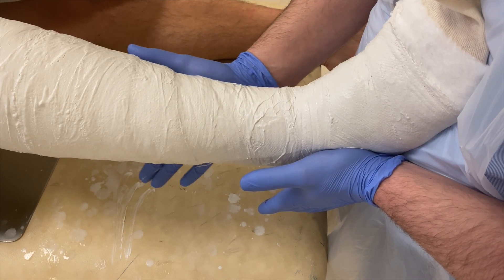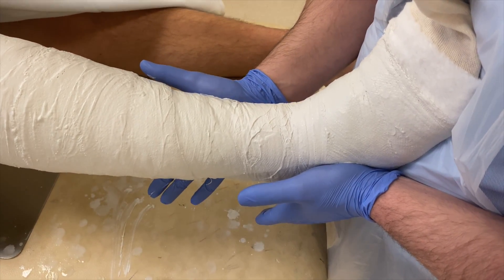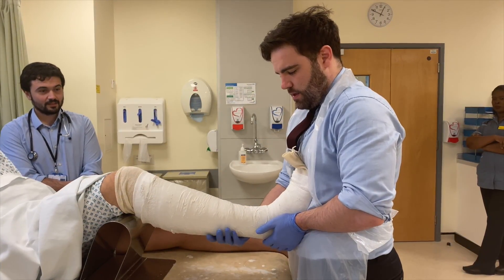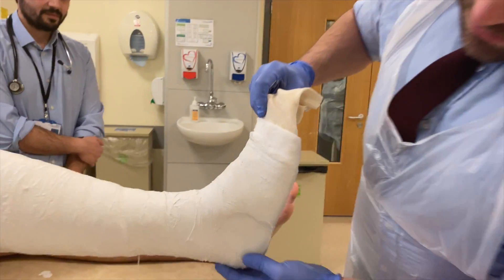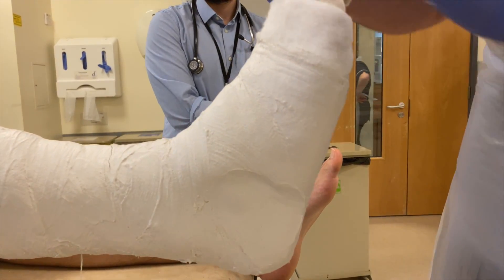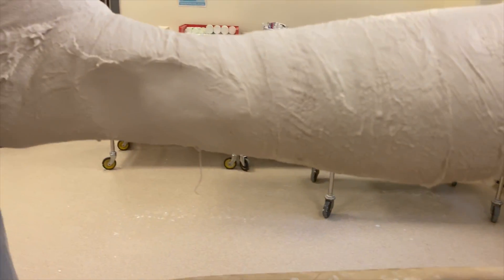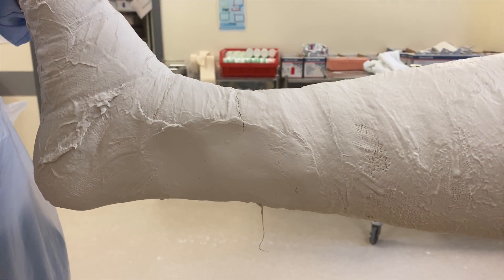We just continue keeping our fingers out of the cast so we're not creating indents that can lead to pressure sores — just continued pressure, keeping it very smooth. If you want to have a look at the molding here, you can see there's a big mold there, no hand prints. And on this side there's another nice big mold there — and that's what you're trying to achieve.